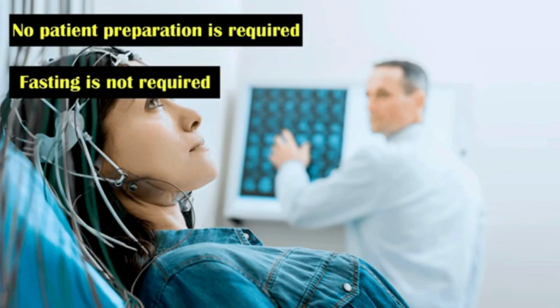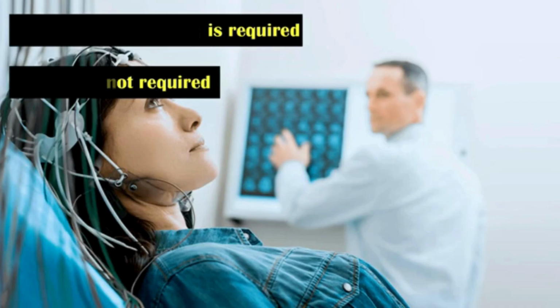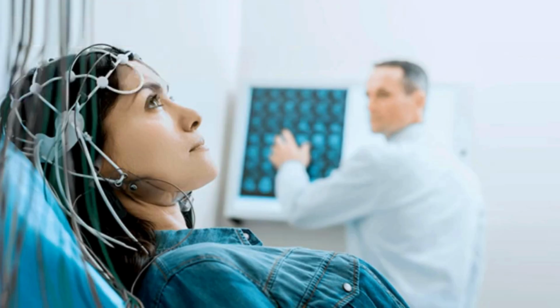Patients should make sure their hair is clean and dry, and they should be advised to avoid applying hair gel and wax before coming for the procedure. Before starting the test, the scalp should be cleaned. After that, about 20 electrodes, which are connected to a recording machine, are attached to the scalp.